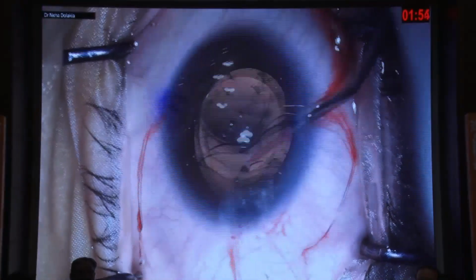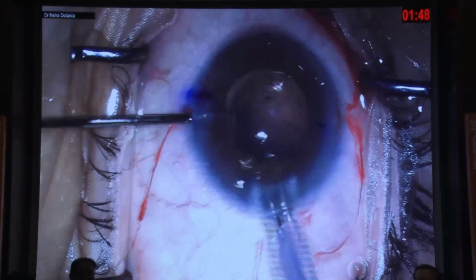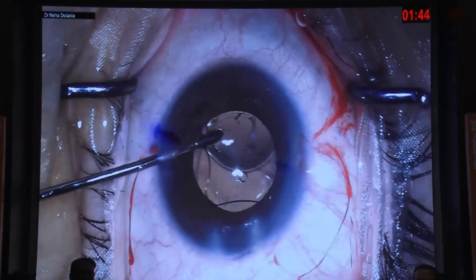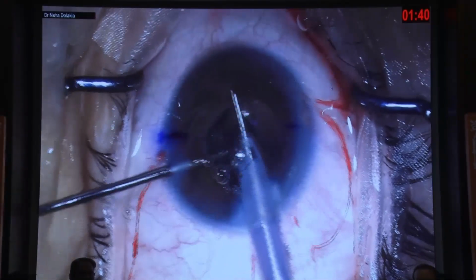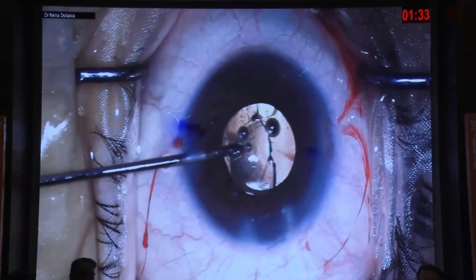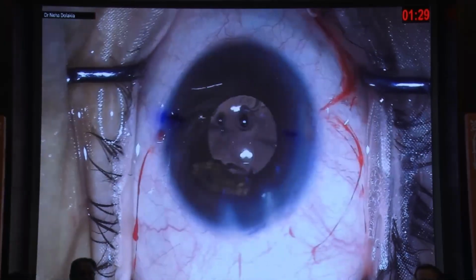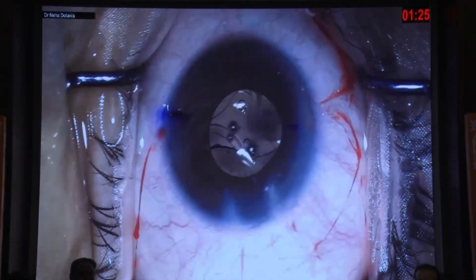One method over here I am using where I have used an IOL scaffold. This was a patient intolerant to the trifocal lens. It was a toric lens, as you can see, but in spite of all that, one has been able to cut the lens easily into 4 pieces. These are very tricky situations. Here I have used a scaffold to protect the posterior capsule in case of chamber fluctuation.